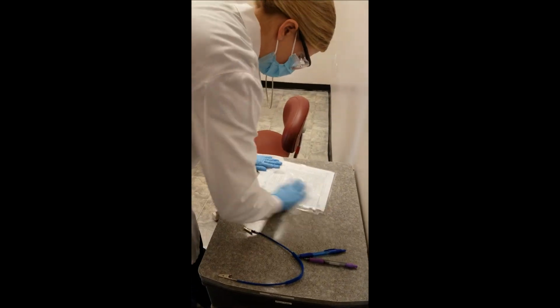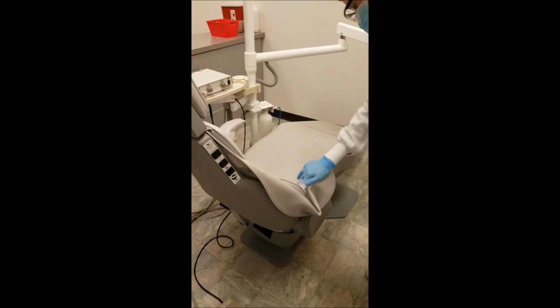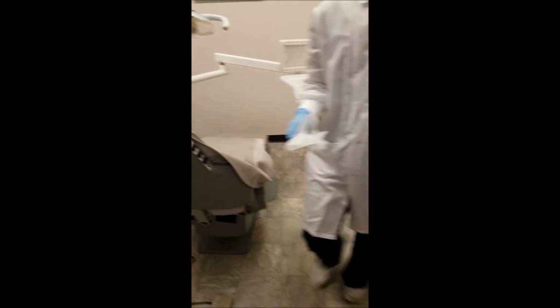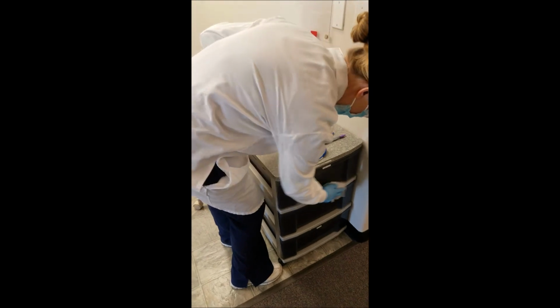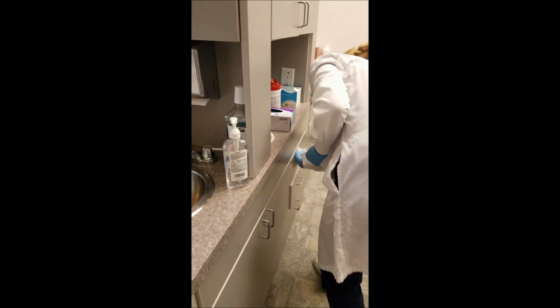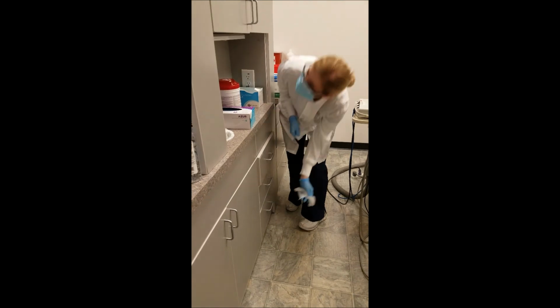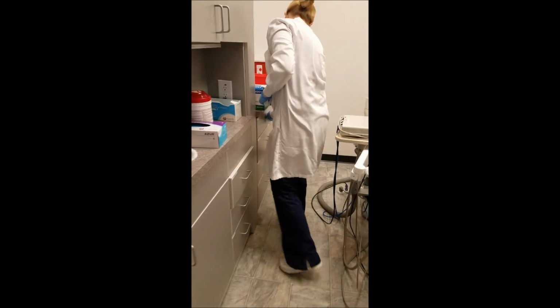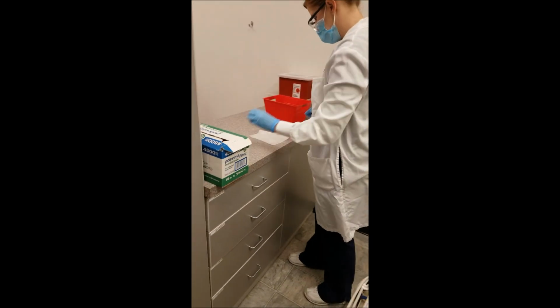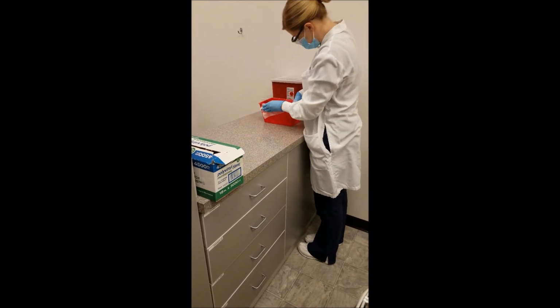Good. And then she will wipe down the patient armrests. And then the drawer handles. And then the countertops. And then that is the red bin that should be wiped down inside and out.